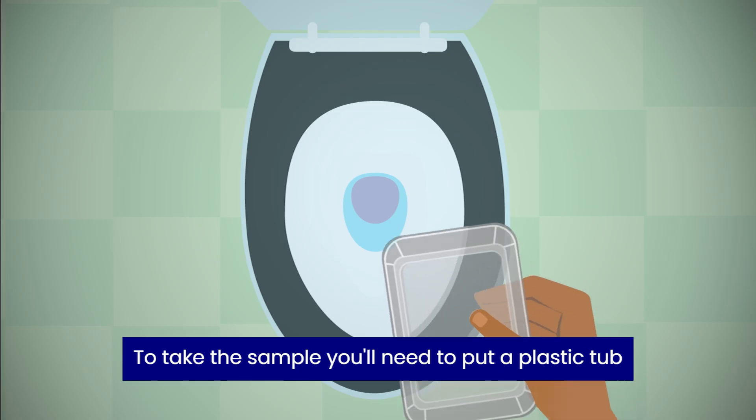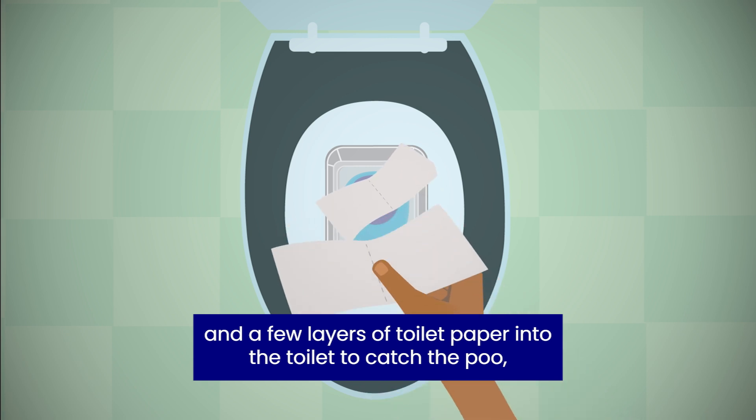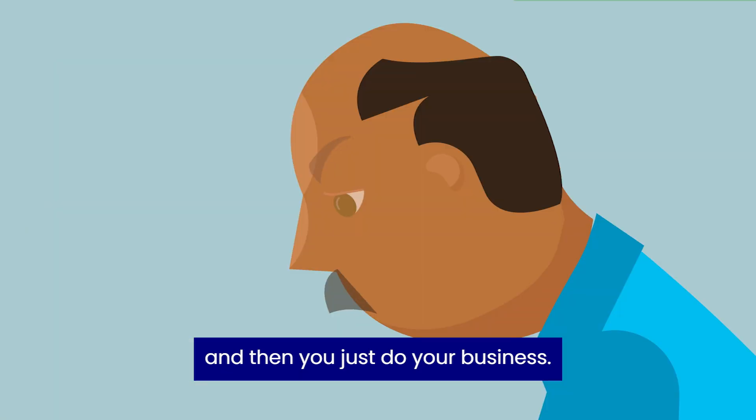To take the sample, you'll need to put a plastic tub and a few layers of toilet paper into the toilet to catch the poo. And then you just do your business.